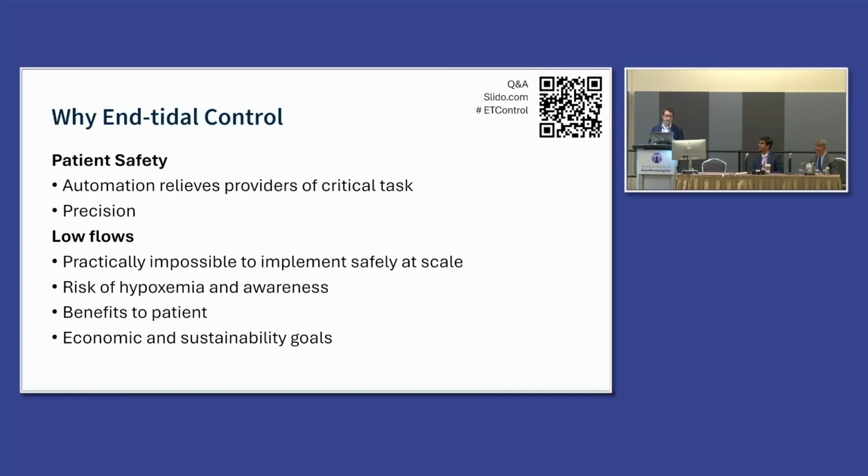And actually, that was exactly what happened during our whole process, which took about 3 years. We moved away from nitrous oxide, eliminated it as a familiar story. I'm sure you've heard it a lot of times before. Moved to sevoflurane at low flows. The costs of the gas were exactly the same as when we started using nitrous oxide, except that we'd managed to reduce our greenhouse gas emission by 90%, which was about 7,000 metric tons of CO2 a year. It's about 250,000 miles driven every year. And this technology, I think, was crucial in allowing us to do that.